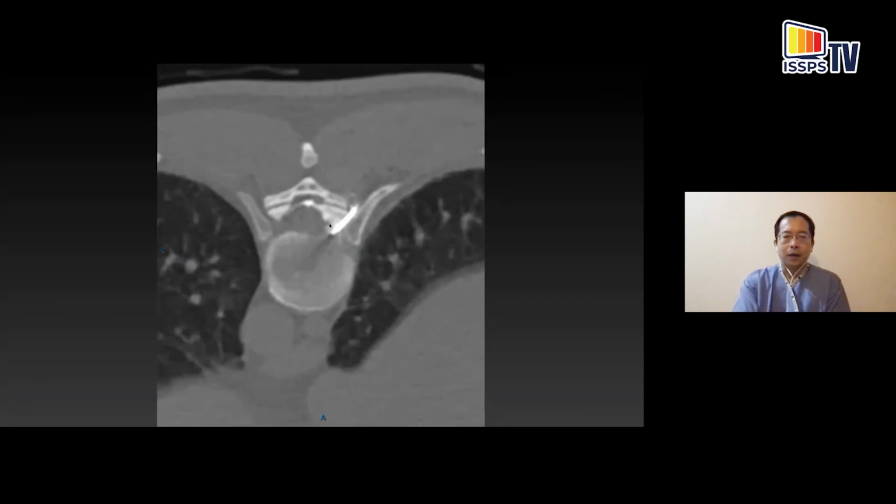We did the thoracic epidural injection first with a bit of local anesthetic and contrast. So you see these white little patches tracking along the posterior aspect of the thecal sac as well. That's confirming that we are in the thoracic epidural space, and that's coming out into the foramen slightly inferiorly.